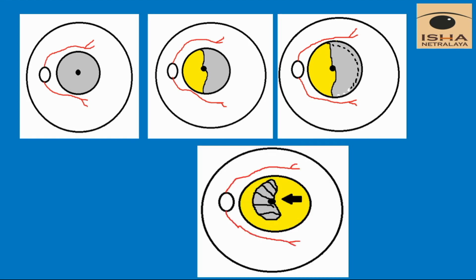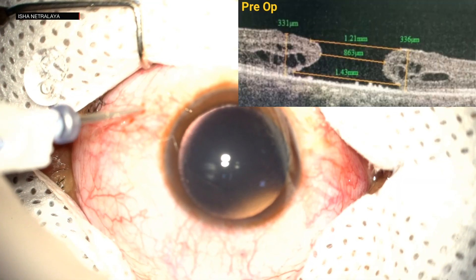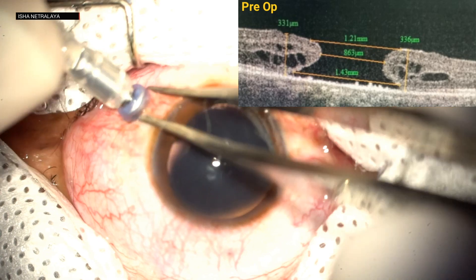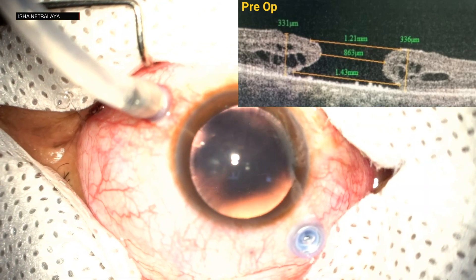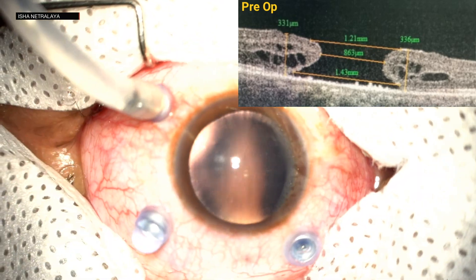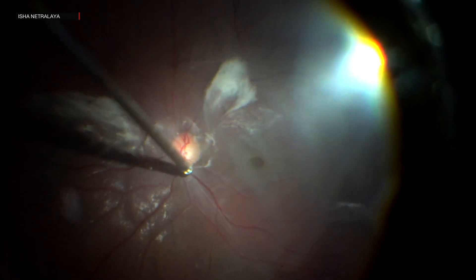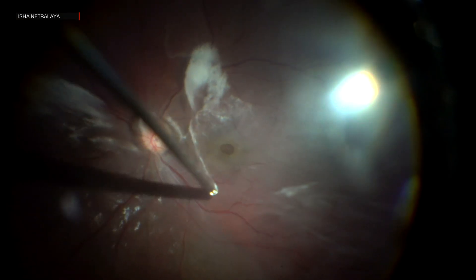Now let's see the surgical procedure. In our first case, there was a traumatic macular hole of a 25-year-old male with best corrected visual acuity of counting fingers at 2 meters. 23-gauge sclerotomies were made and a core vitrectomy was done. The vitreous was then stained with triamcinolone acetate and PVD was induced.